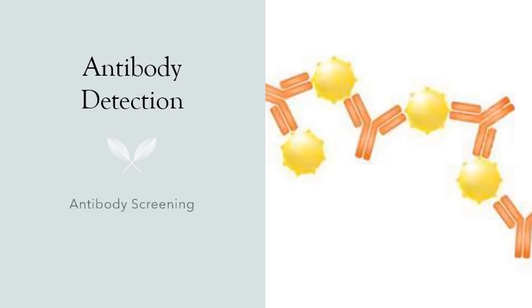Antibody detection or antibody screening is critical in pre-transfusion compatibility testing. So it is one of the principal tools for investigating potential hemolytic transfusion reactions and immune hemolytic anemias. So it also aids in detecting and monitoring patients who are at risk of delivering infants with hemolytic disease of the fetus and newborn.